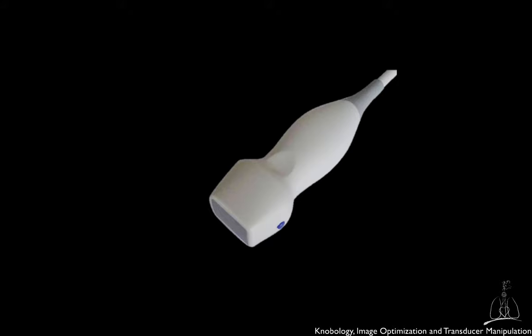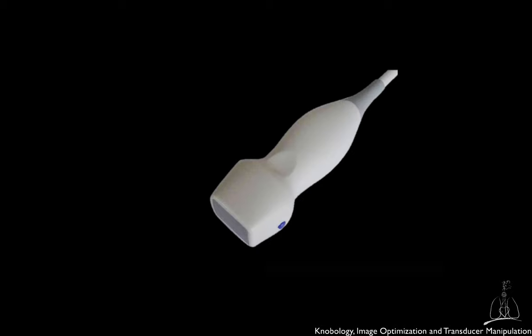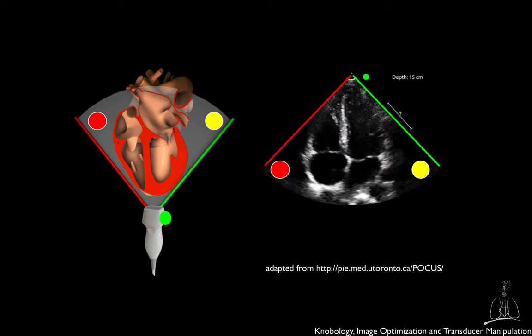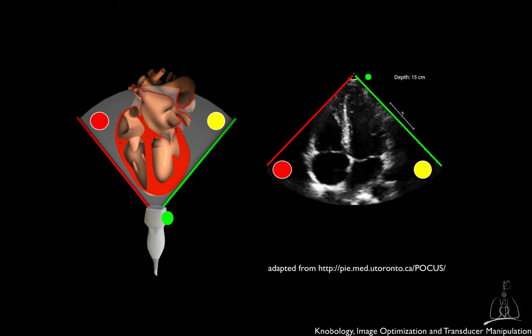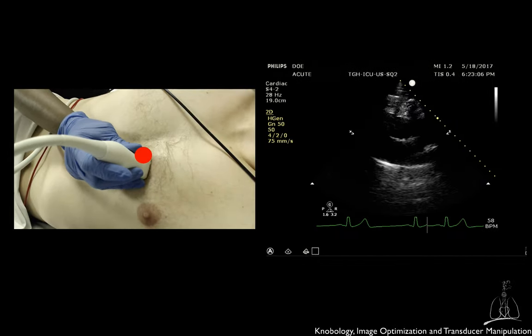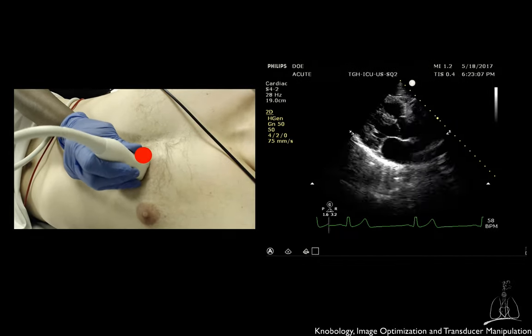Determining the probe orientation is crucial for correct image interpretation. Transducers have an indicator or marker, usually an indentation or a light, on one side. This marker helps orientation in two key aspects of image acquisition: number one, how the marker is oriented relative to the screen, and number two, how it is positioned relative to the patient.